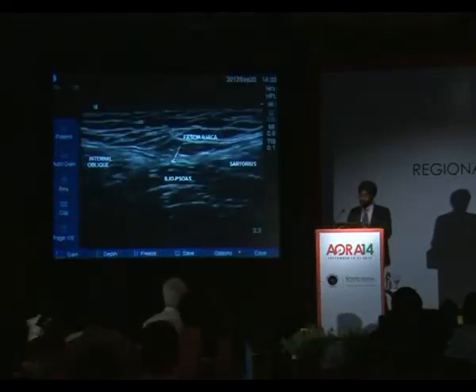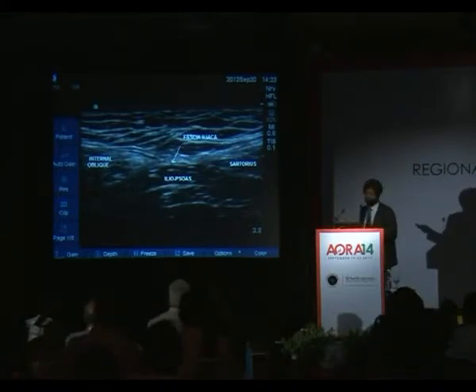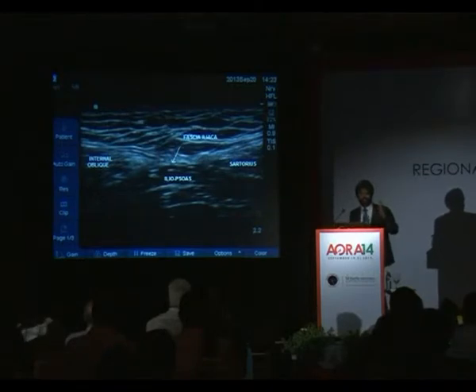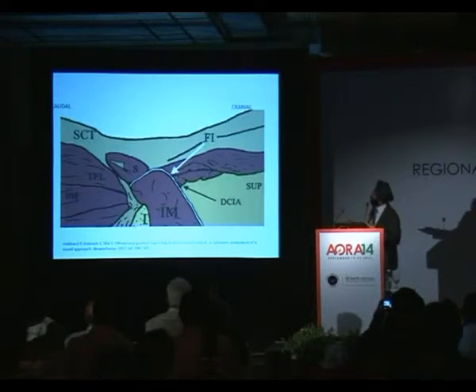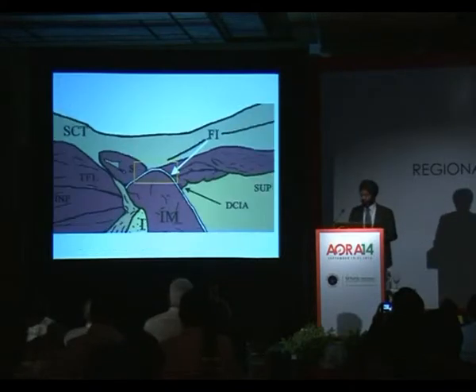Okay, so before I go on to the video, let's have a look at this pattern again. It should sound a bit more familiar. What if we take a parasagittal, actually an oblique parasagittal section, just where we have kept the probe, so you get a picture like this. The only thing the artist has done is just invert the cranial and caudal. So you have your sartorius, you have your internal oblique, and you have your iliacus muscle here, and you can see your ilium down there. So what we need to focus on is this part of the anatomy.